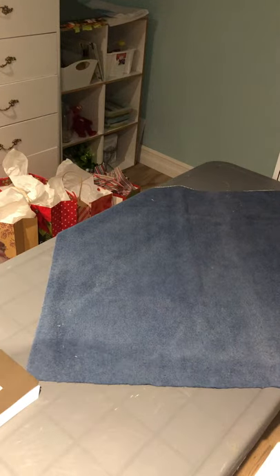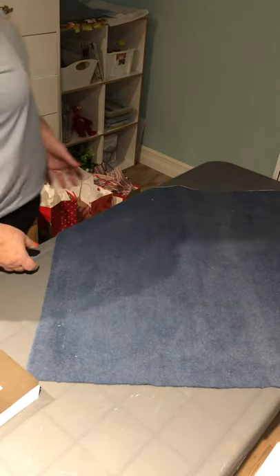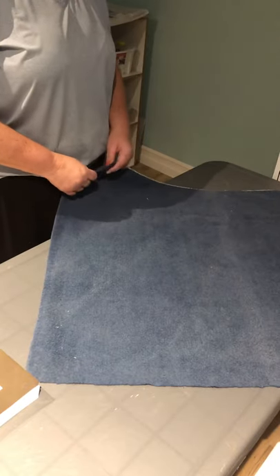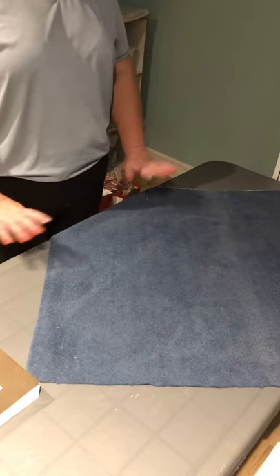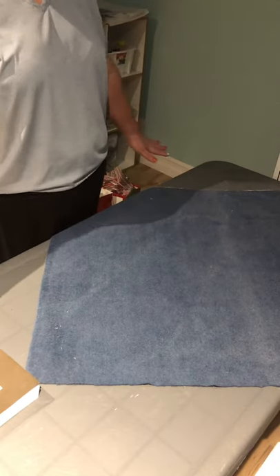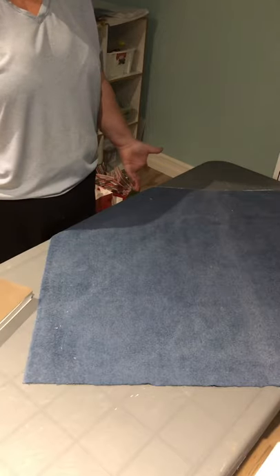Hi, my name is Mary Wardle and I'm going to be demonstrating the envelope wrapping technique. For this purpose I have used a towel, and I'm using my book as a package to wrap.